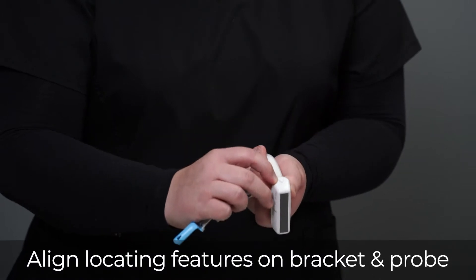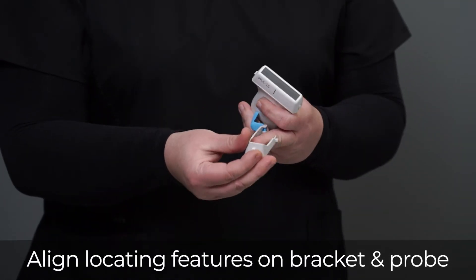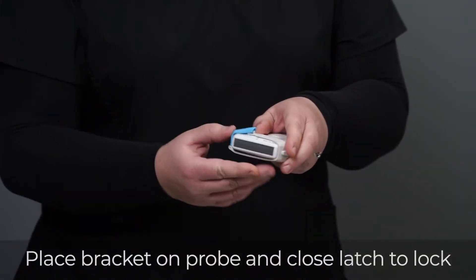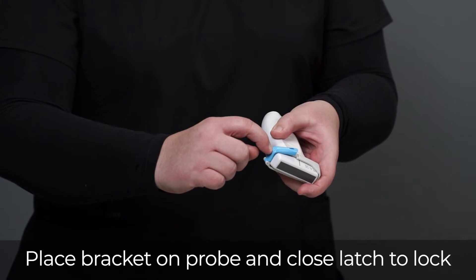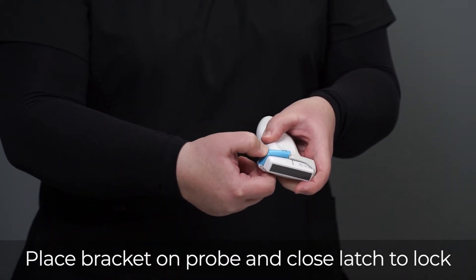To do this, you'll want to note the locating features on the probe aligned with the locating features on the bracket. Once you've done that, you'll apply the bracket and close the latch. There are touch points on each Versa bracket latch that you'll want to push on to lock the bracket into place.